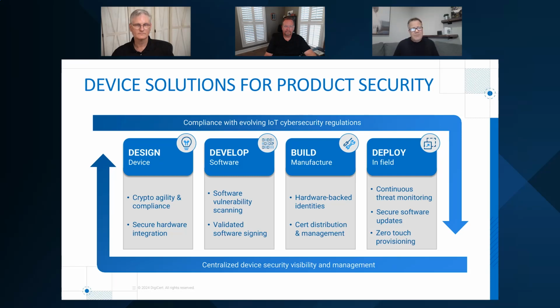A lot of people think zero touch has little to do with security, but it does, right? The less people touching the device, the better. If you have field techs going to hospitals with a laptop and a USB stick in order to provision that device, that introduces potential areas of vulnerability and weakness.